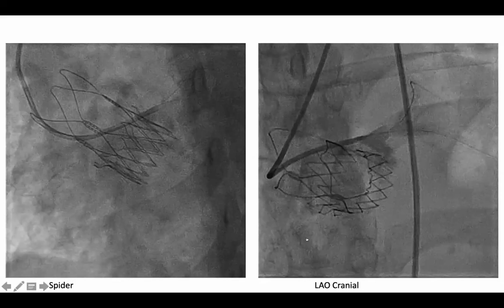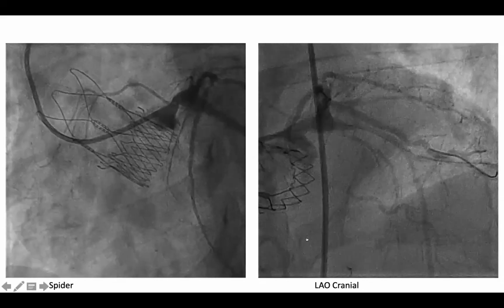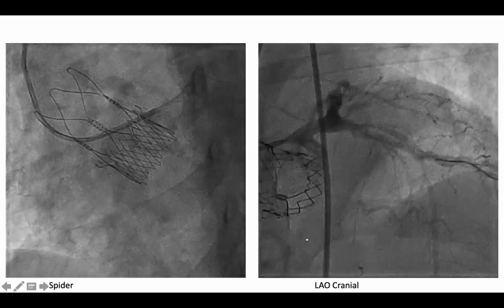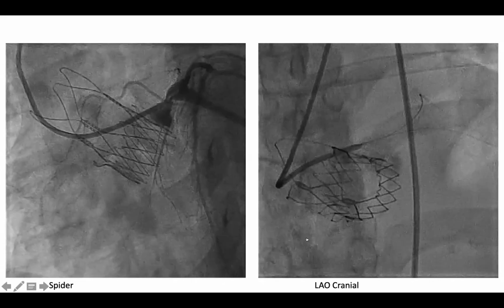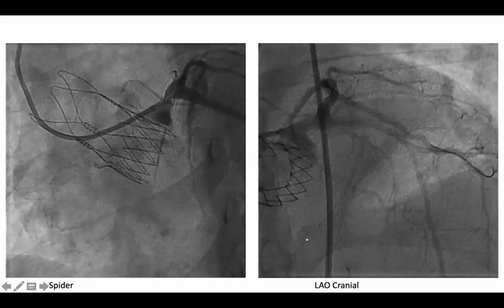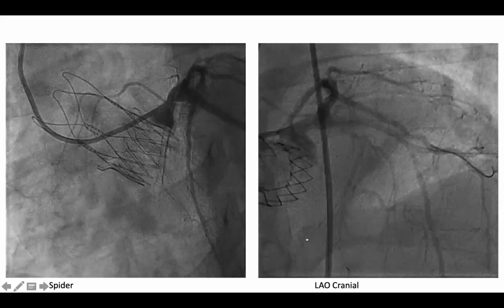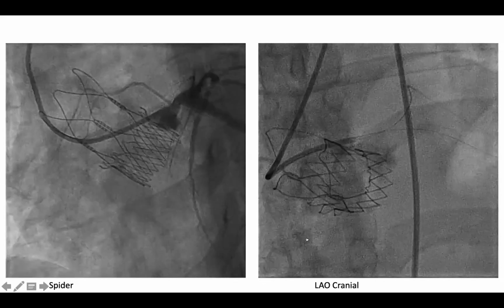One is, if the patient was in cardiogenic shock, did we still need to do the right coronary artery shot, or should we have gone straight for left main? First of all, in the case of a primary PCI, you can never be sure which artery is the culprit.